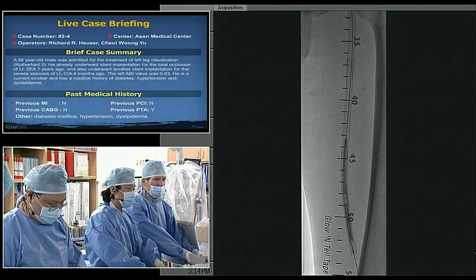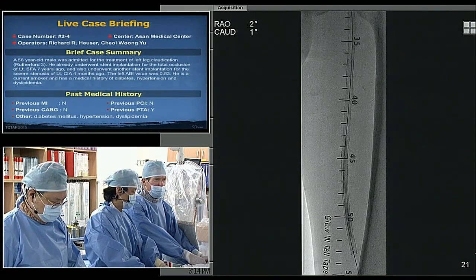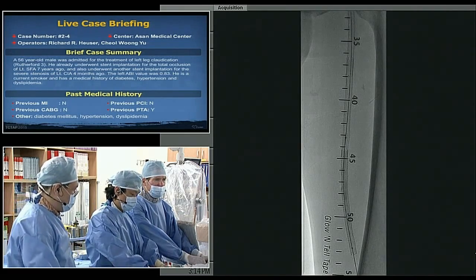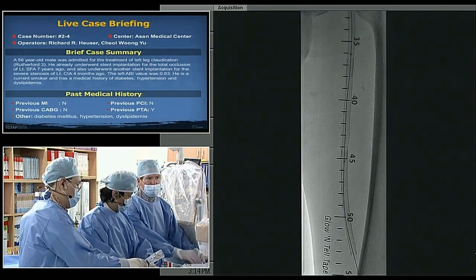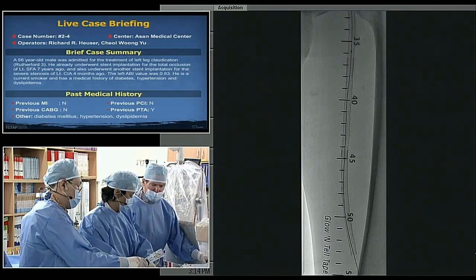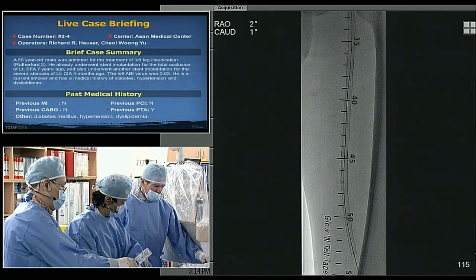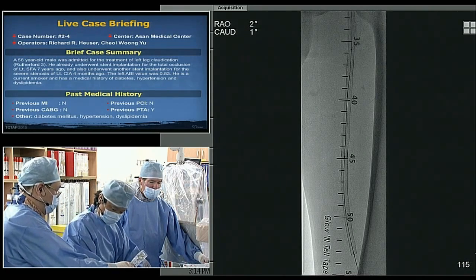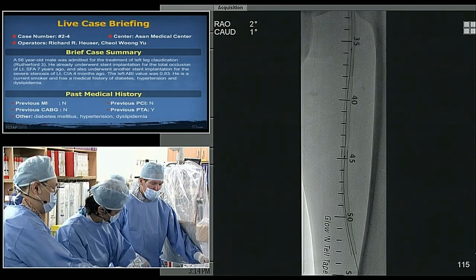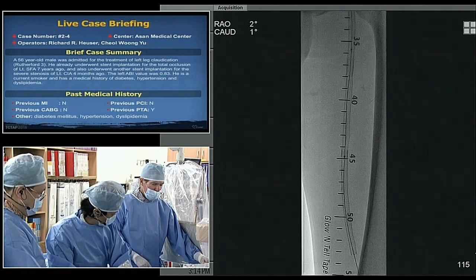Also, I want to clean up more inside the stent, so I want to use a laser catheter in this situation. Let me ask you how to use the laser for this kind of instant restenosis. So you will use the Turbo-Tandem? Yes, initially I use the simple laser, then I use the Turbo-Tandem to clean up more.